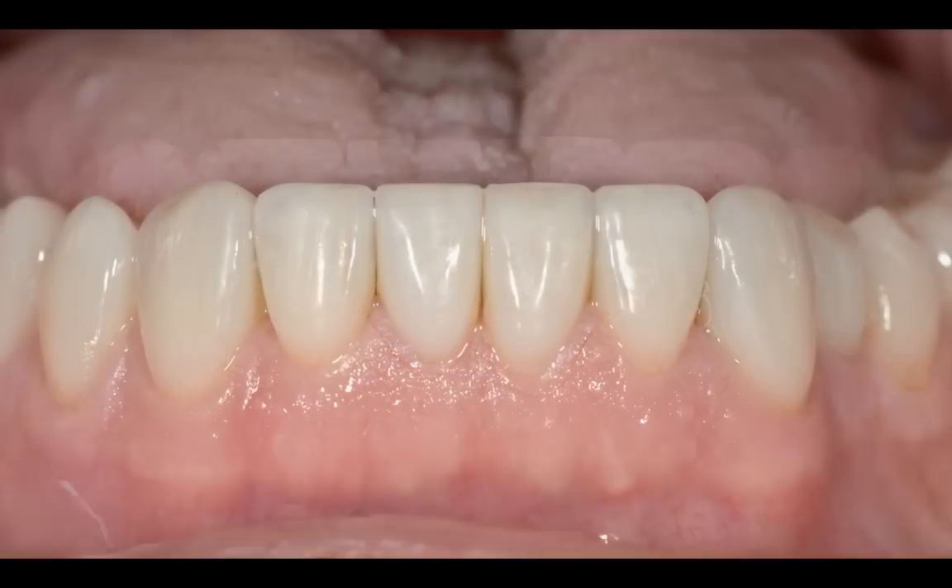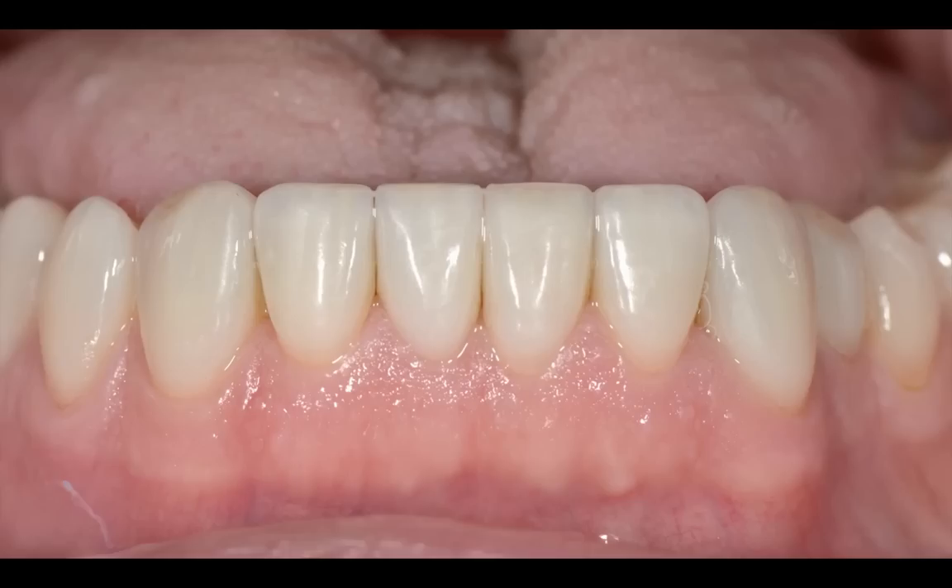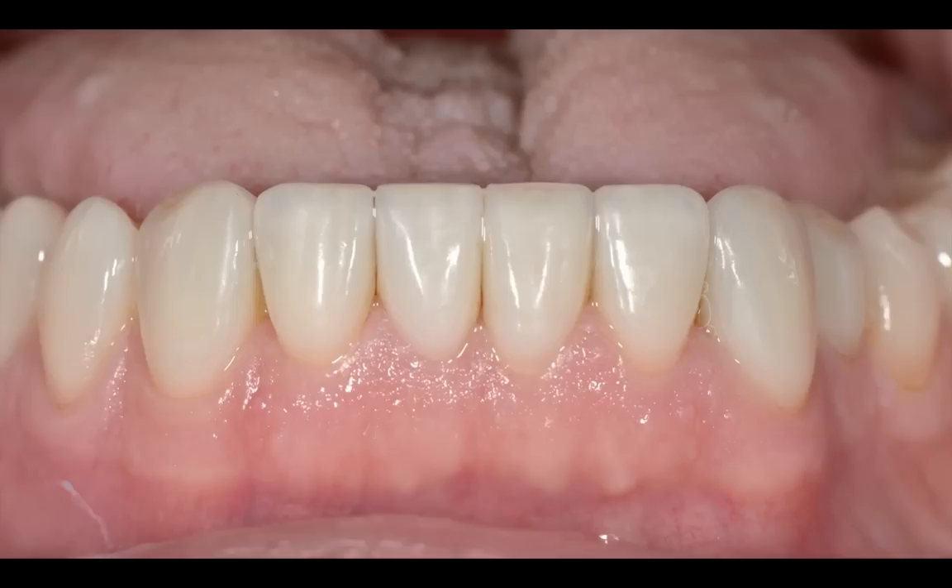And here are the restorations in the mouth. I actually shot this photograph this morning — he came in for his post-op and everything was good. I adjusted one molar restoration, a little bit of an incline on the lower right second molar. Other than that, I didn't adjust anything. It was a pretty easy insert and pretty easy follow-up. You can see the tissue health is really good.